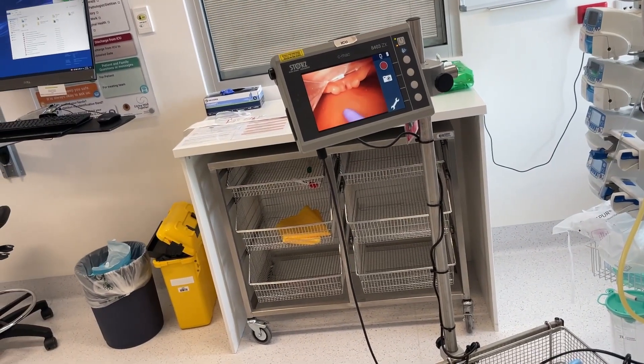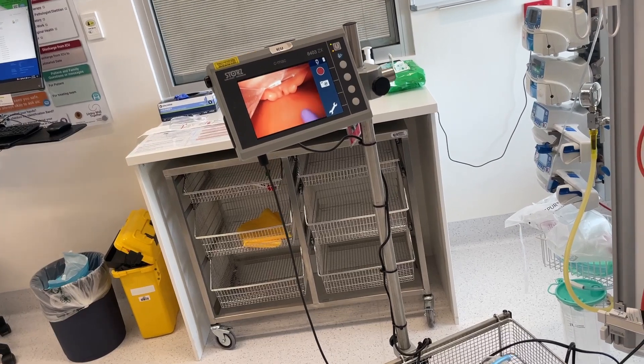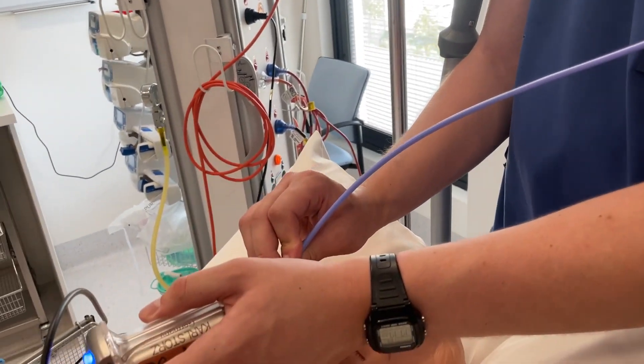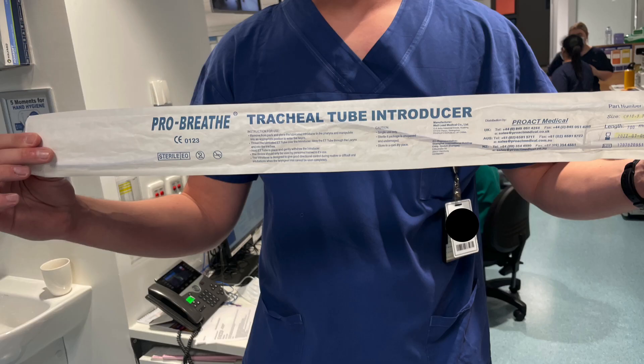Here's the ProBreathe, and it's virtually impossible to direct it anteriorly, even with the coude tip — even when you try to use the tip by bouncing it off the top teeth or your fingers to apply the micro skills. It's evident why: look at the bend in the bougie. It's not maintaining its straight line, and in fact that bend is in the opposite direction to the coude tip. So it's just flopping down into the posterior part of the airway and will not allow you to manipulate it anteriorly.